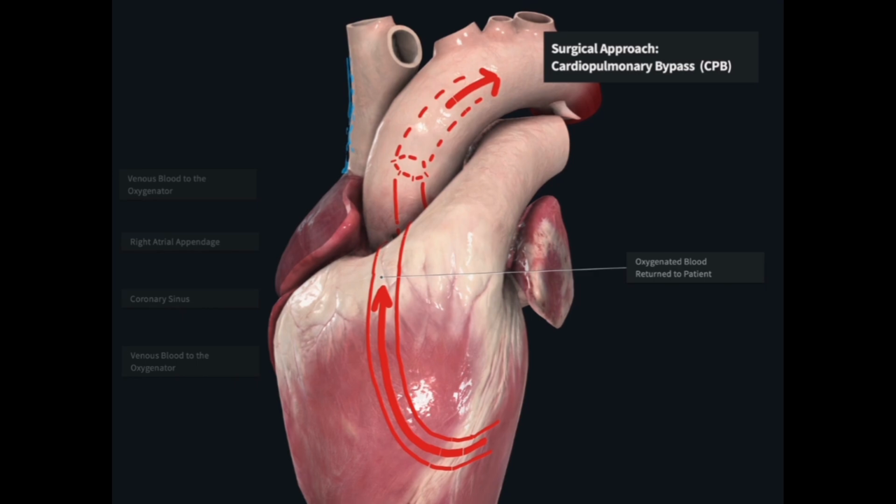Cardiopulmonary bypass is not physiologic. It results in several metabolic derangements, including a bleeding tendency secondary to platelet sequestration, clumping in the oxygenator, and diffuse systemic inflammatory reaction with third spacing. This is why anticoagulation and antifibrinolysis is required.